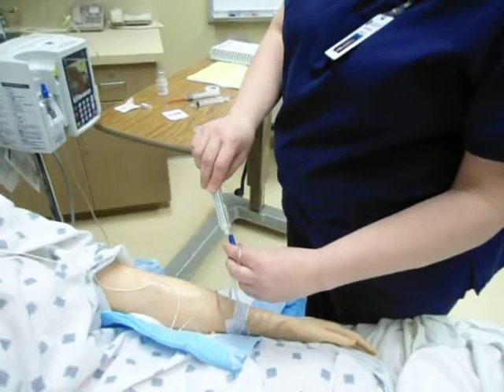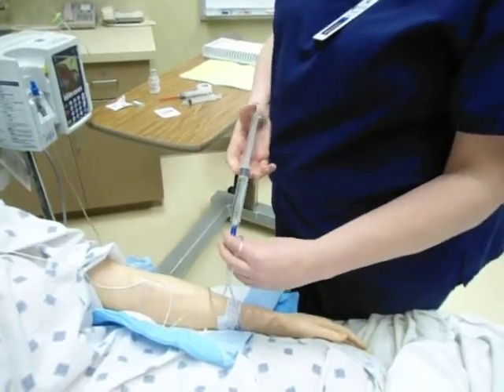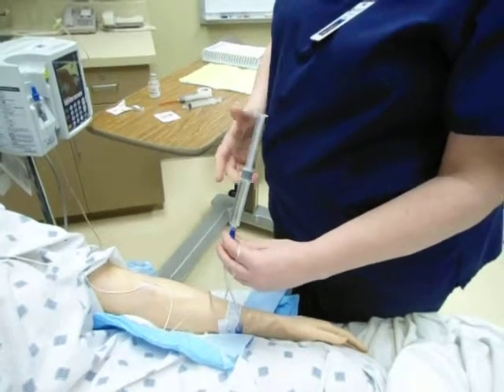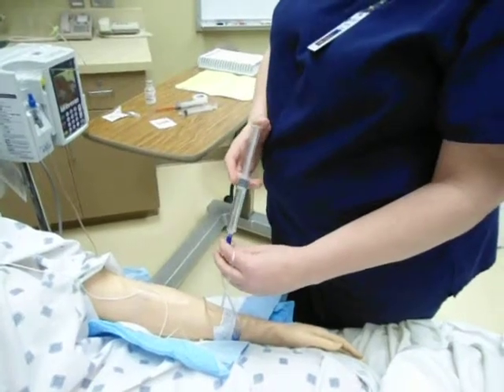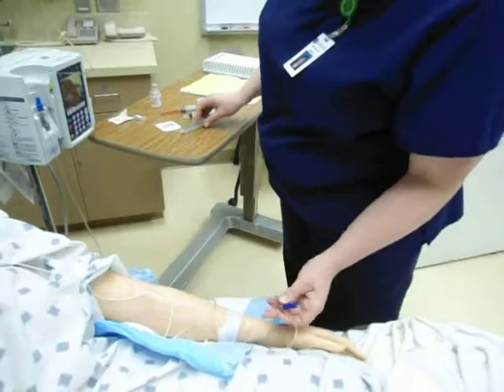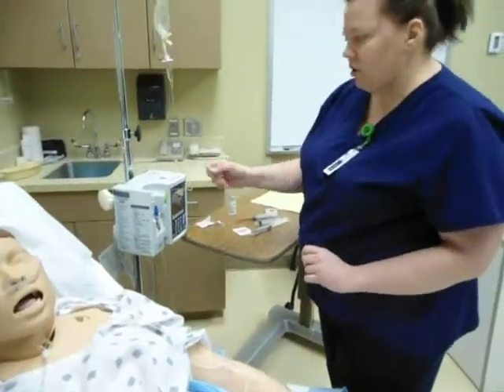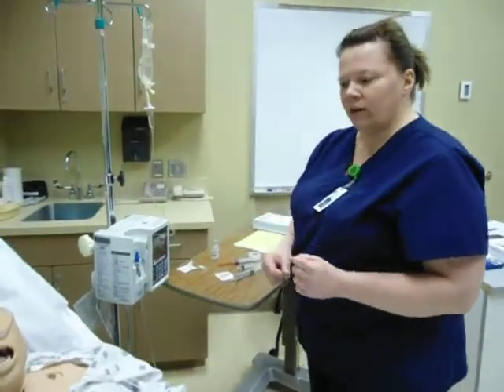I'm going to go ahead and put my normal saline flush on there again, and over 3 minutes I'm going to deliver 1 milliliter per minute at the same rate that I delivered the Verapamil. So I've done that, taken it off. I'm going to go ahead and start my machine up again after I've unclamped it.